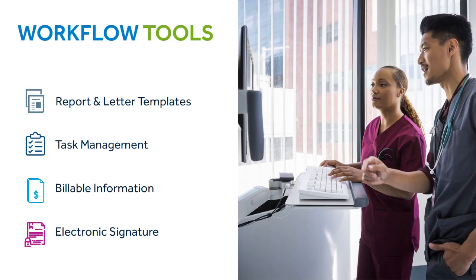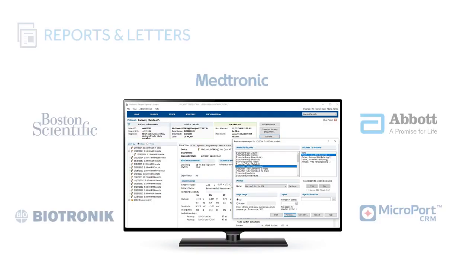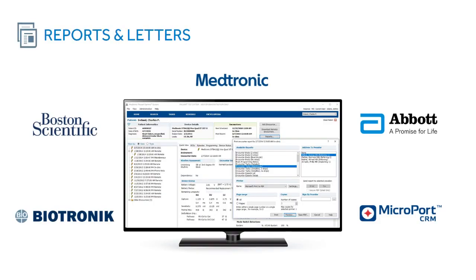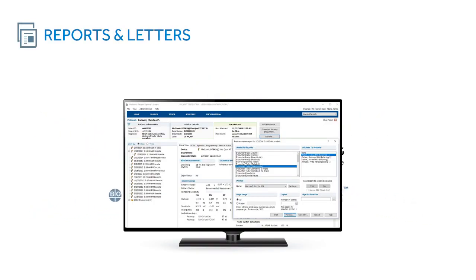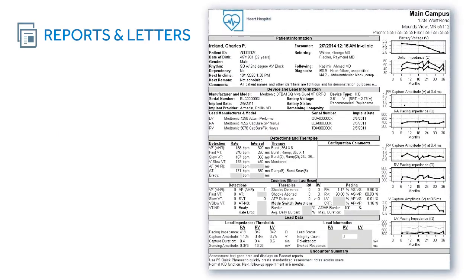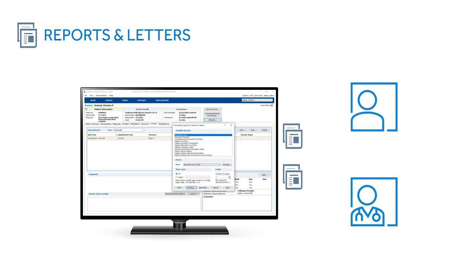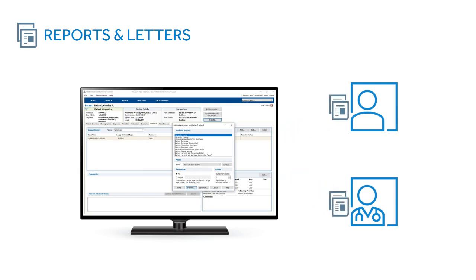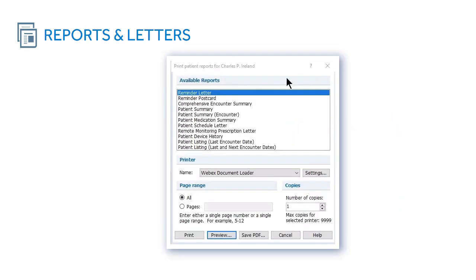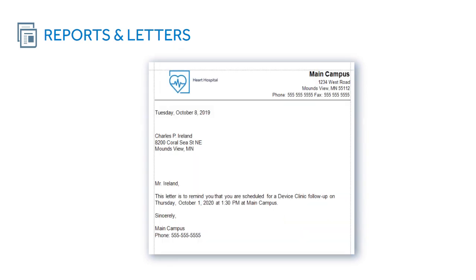PaceArt Optima streamlines your workflow and increases clinic efficiency with flexible tools tailored to your individual needs. PaceArt consolidates the data from all the major cardiac device manufacturers into a standardized report. You can also quickly generate letters to patients and providers. The report and letter templates are created for you.